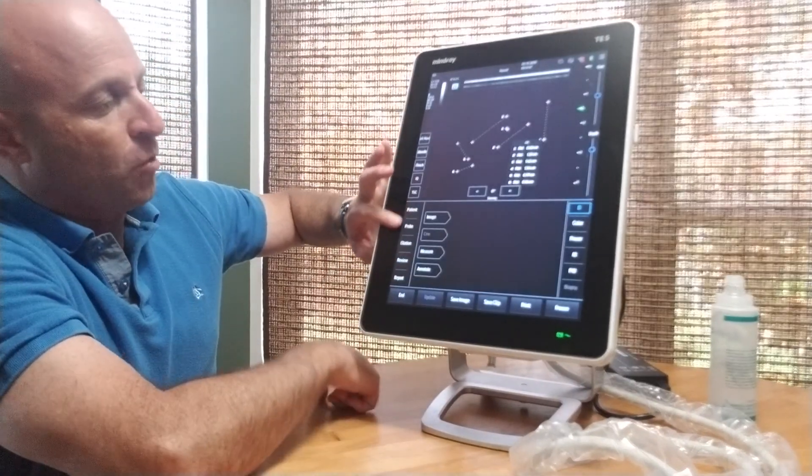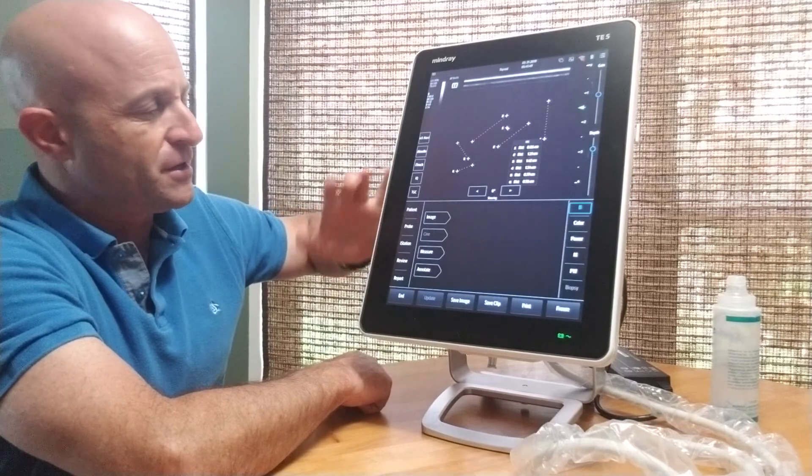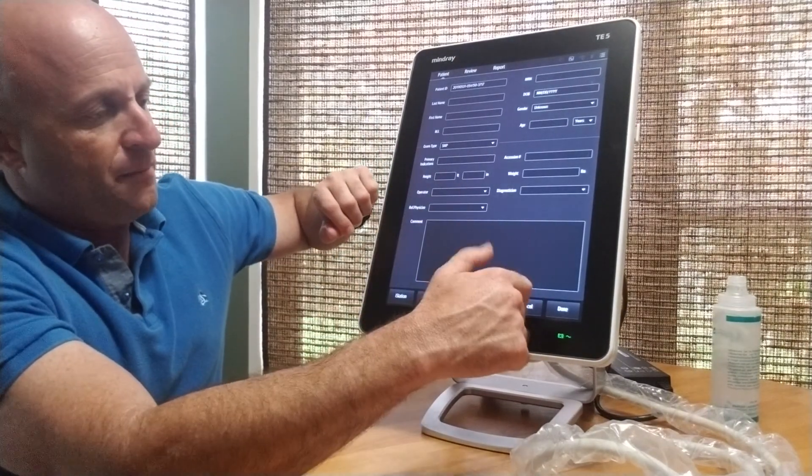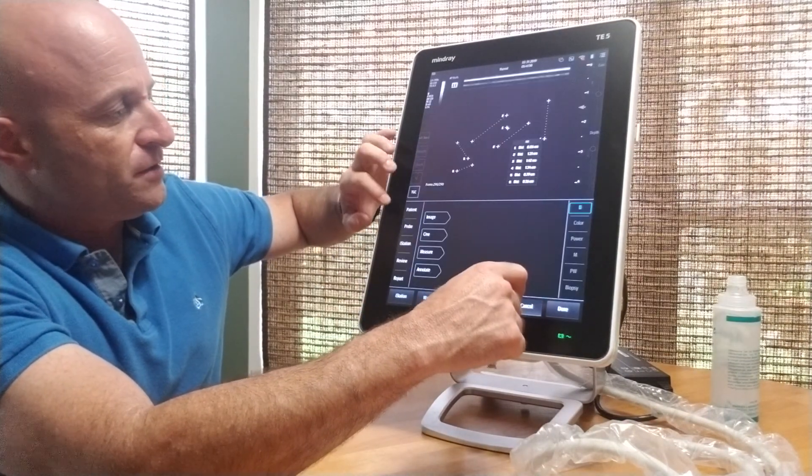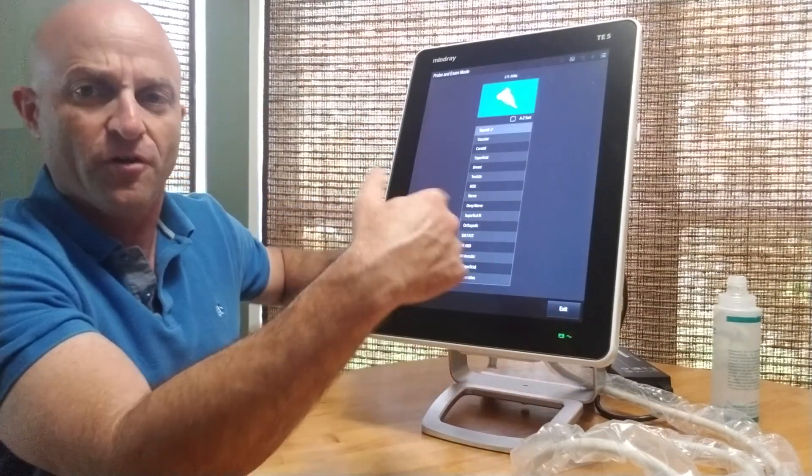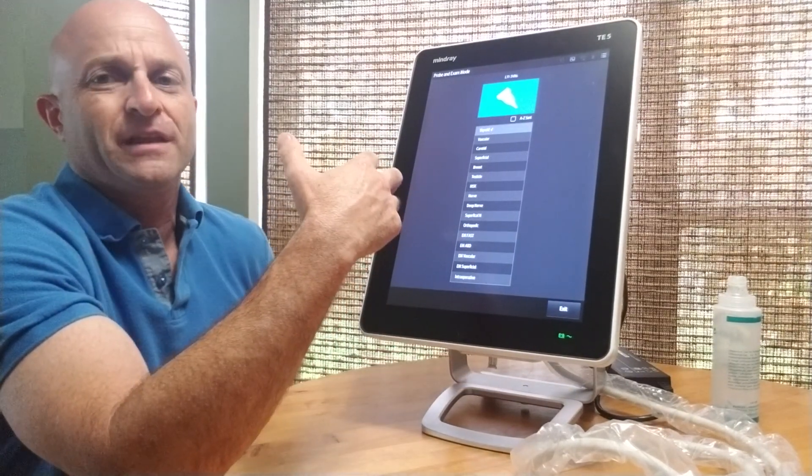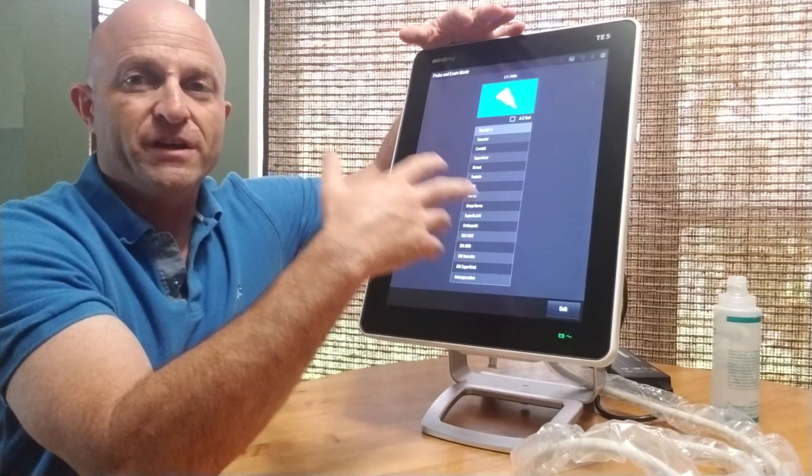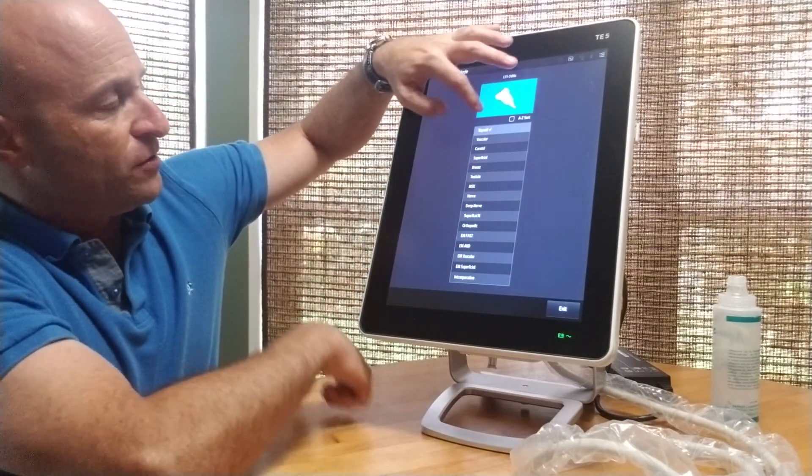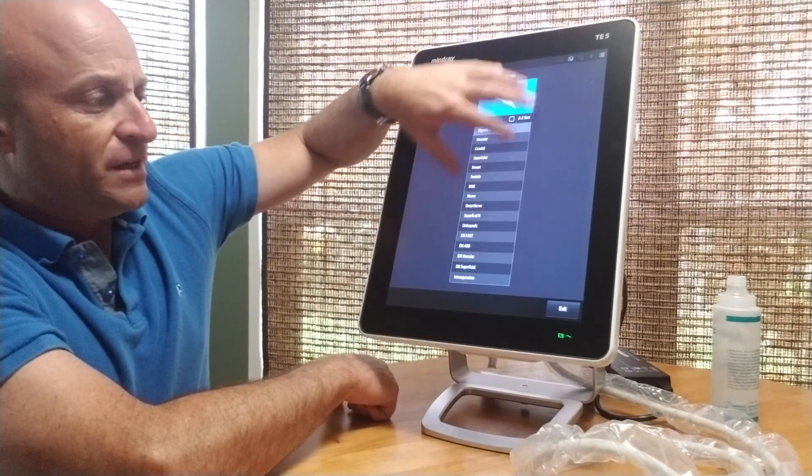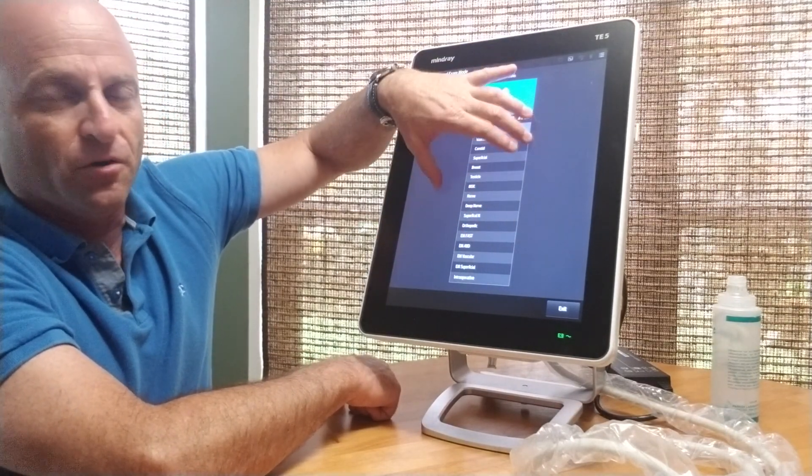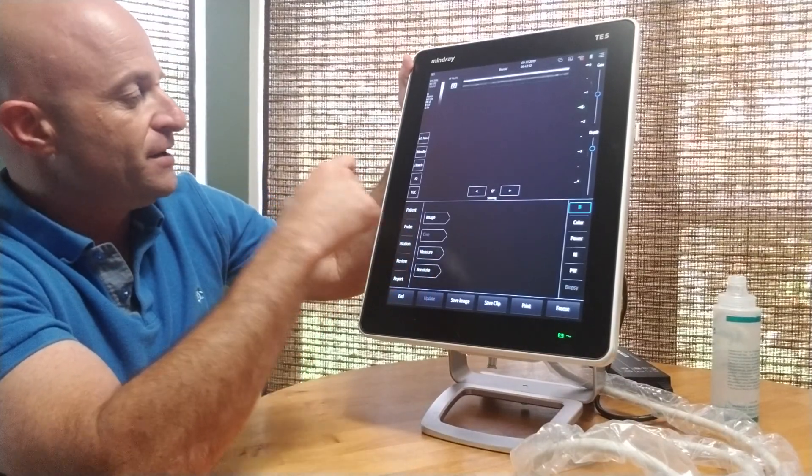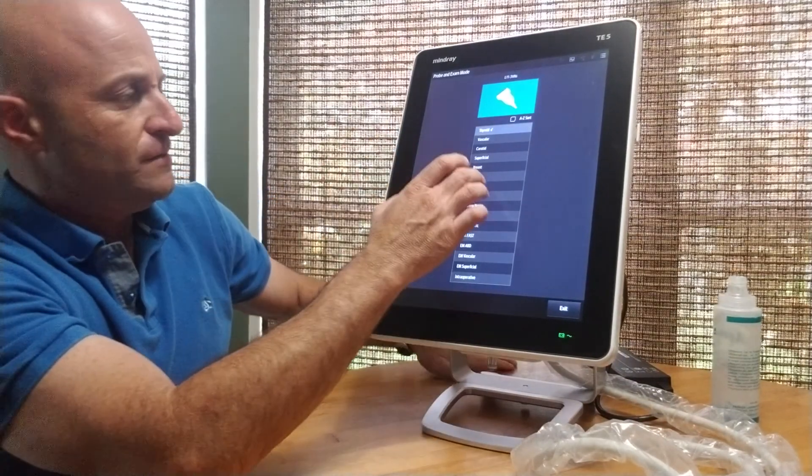From a workflow perspective, this is very similar to other Mindray systems, where we can go from patient input entry to probe. On probe selection, you select the probe as well as the preset you're planning to work with. Here you see thyroid, vascular, carotid. This can be configured to show only the specific presets you'll be working with.